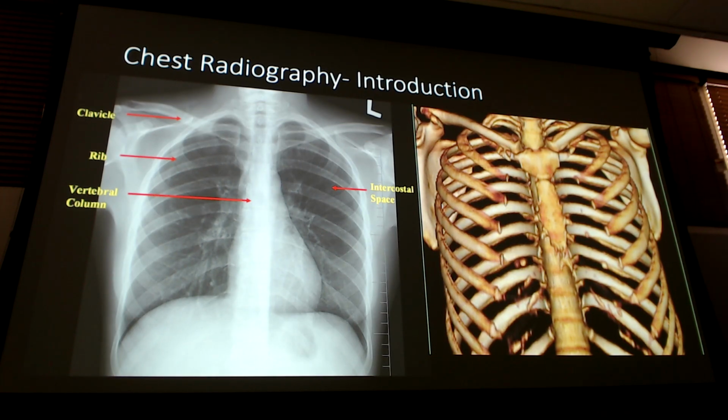Yes, sir? Just out of curiosity, how frequently are these reconstructions done? Rarely. It's just a really cool picture to explain the cartilage, so I threw it down there. It's more like intensive surgery they requested. Yeah, so ortho will do it sometimes, primarily to really look at those nasty fractures. But something like this with the rib cage is almost never done.